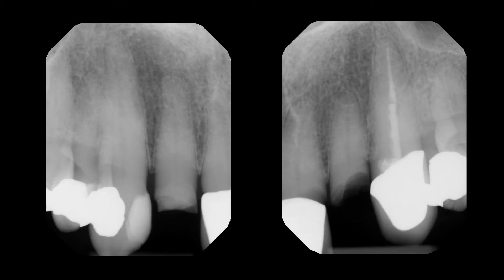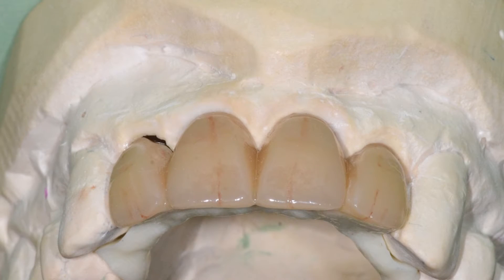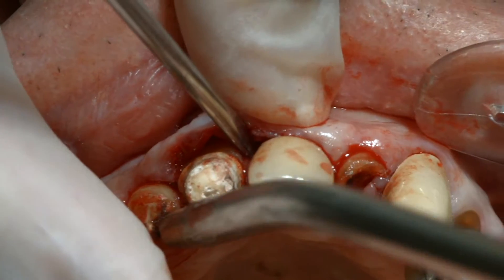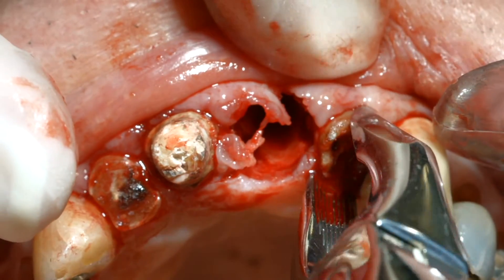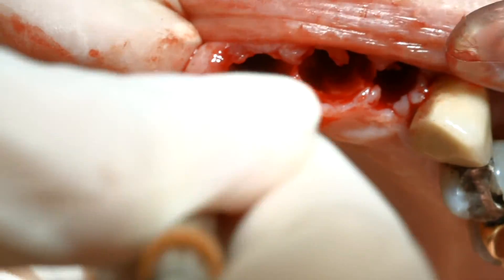The treatment of a 75-year-old man began with the laboratory fabrication of a clear resin surgical guide and a TRINIA and ceramage transitional stabilizing prosthesis. With local anesthesia, the patient's four maxillary incisors were extracted and their sockets were curetted.